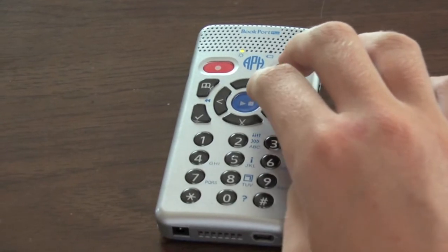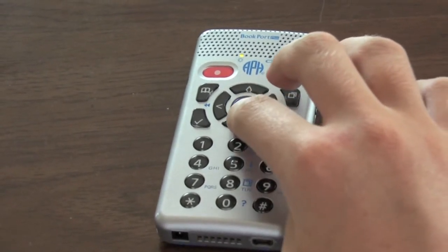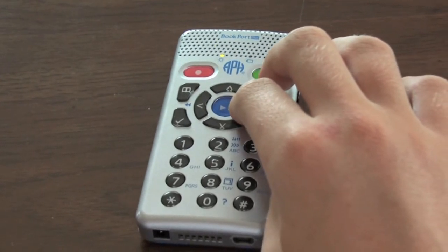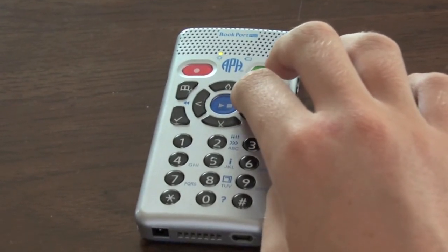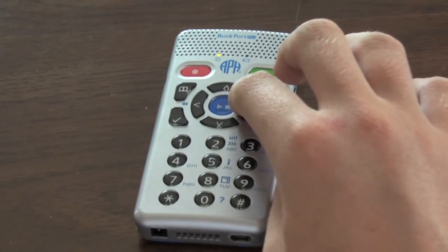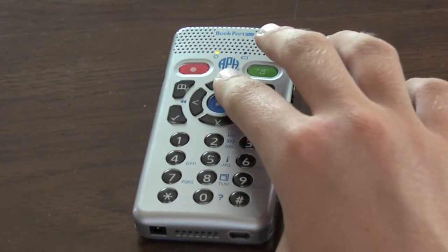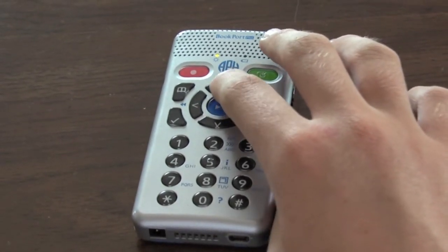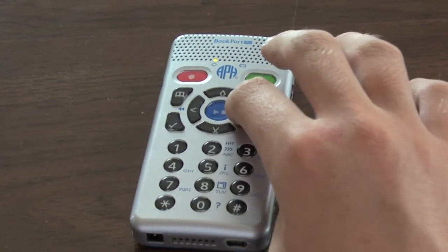So let's go to the right again. Text-to-speech voice. We'll go into this with down arrow. Enter. US English, Samantha. We have US English, Samantha, or US English, Tom. So we have a male and a female voice. You would choose which voice you wanted by pressing the down arrow. It's already on the one I want, so I'll just cancel out with up arrow.